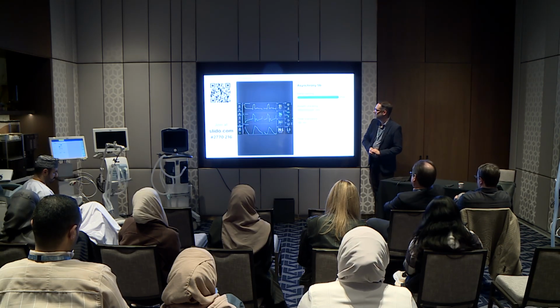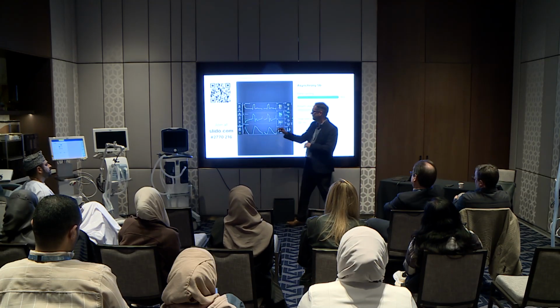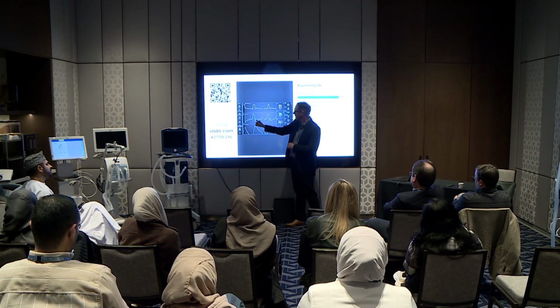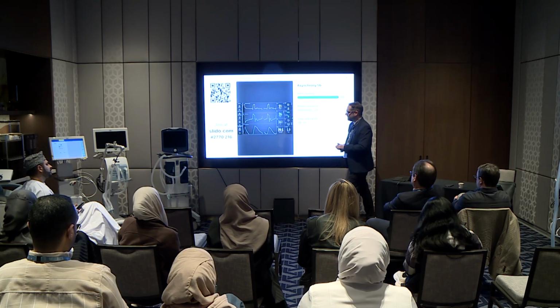Recycling, very good. Breath stacking, there is no evidence of breath stacking. Again, for breath stacking, you would need 2 breaths without sufficient exhalation. That's 1 breath here, 1 breath here. Again, this is just the ventilator going along. But breath stacking would require 2 breaths immediately, so there's no breath stacking there. Early cycling is the correct answer.